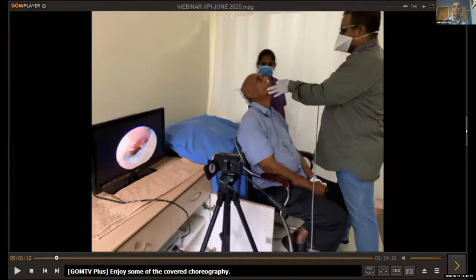Thank you all for this section. We will go forward with the next section, where we will be looking at multi-view video fluoroscopy. I know centers which use endoscopy exclusively for assessment of velopharyngeal dysfunction. There are also centers which use lateral view video fluoroscopy exclusively when it comes to assessments.